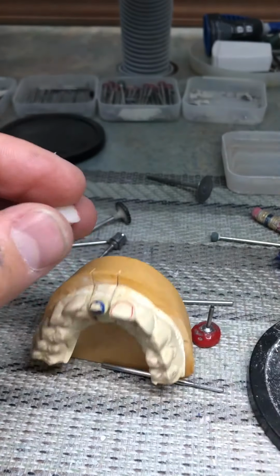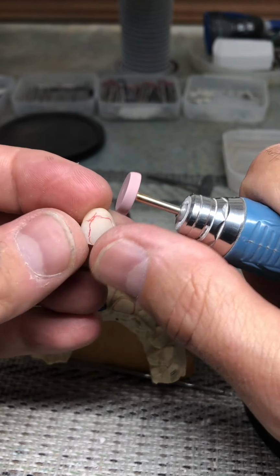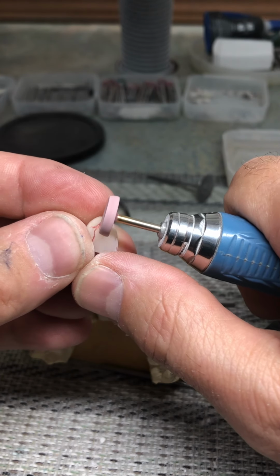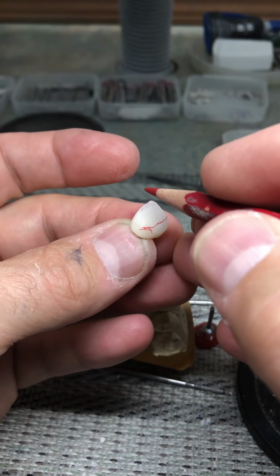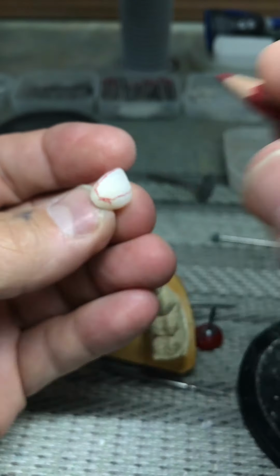So I'll try to adjust that slightly on video. Try to see where we are here. And I'll redefine these line angles that I just adjusted.